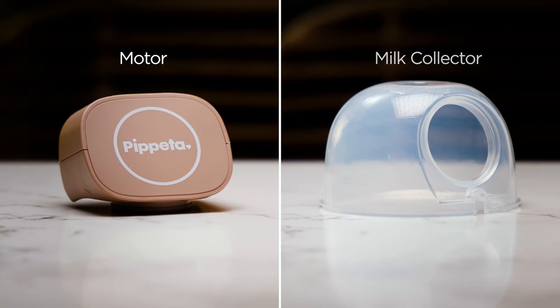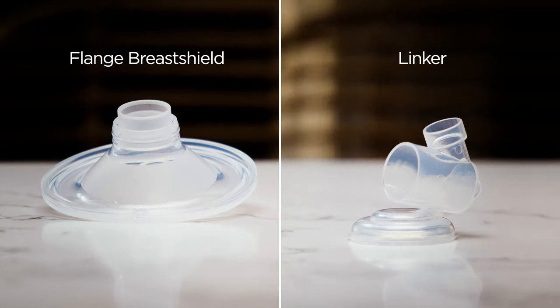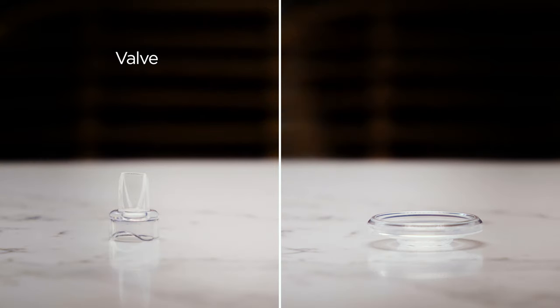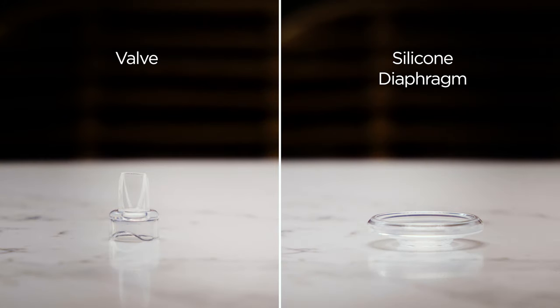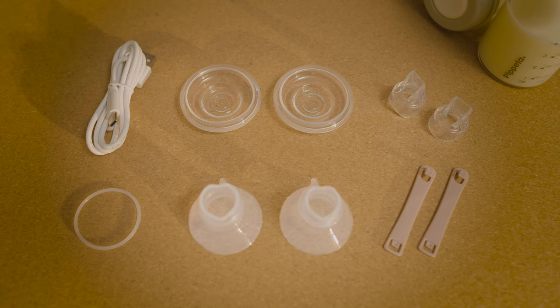The motor, the milk collector, the flange breast shield, the linker, a valve, and a silicone diaphragm. Included in your accessory pack, you will find two spare valves, two spare diaphragms, a spare sealing ring, additional flange sizes, along with bra strap adjusters.